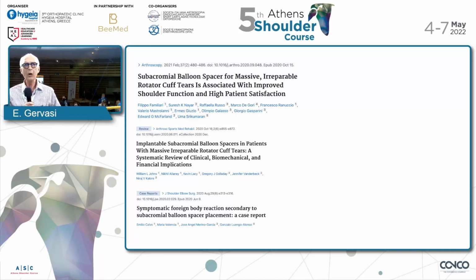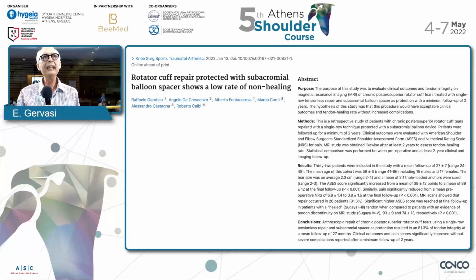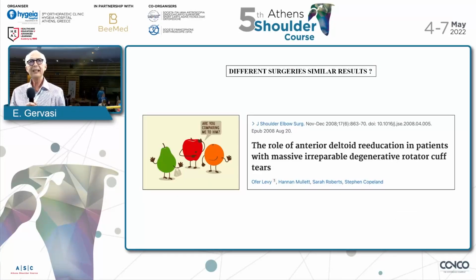And these are all the papers, very important. And this is the other one, cuff repair protected with the subacromial balloon. So this is another option: to put a balloon after the cuff repair in order to lessen the peak forces, the peak stress onto the repair. And I just ended a work doing latissimus dorsi and a balloon over the latissimus dorsi. But not all the different surgeries give the same result.